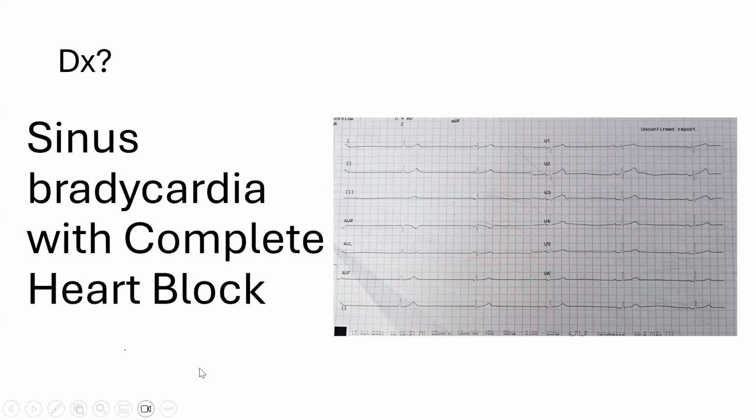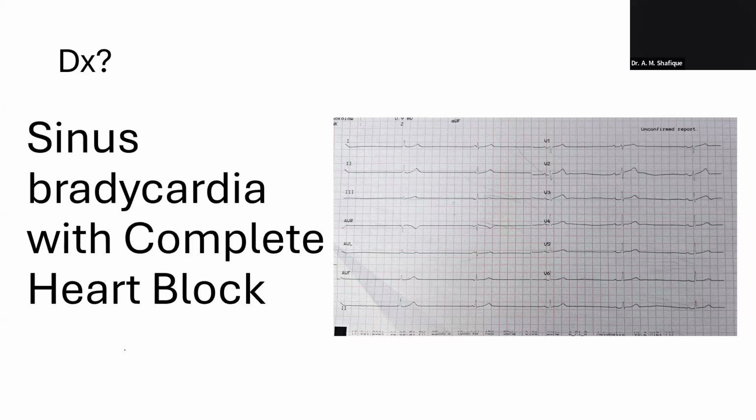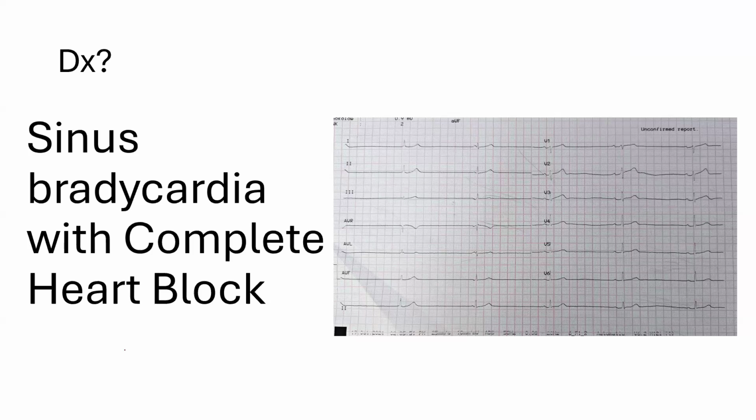Sir, this dissociation is because of the extreme sinus bradycardia. Right, extreme sinus bradycardia resulted in an escape rhythm coming out from the ventricle. So the ventricle is running on its own, and because of extreme sinus bradycardia, the impulse is not reaching the ventricle. So the ventricle itself is producing the impulse. So the dissociation is because of extreme sinus bradycardia, not because of an AV nodal problem. Is that what you want to say, sir?